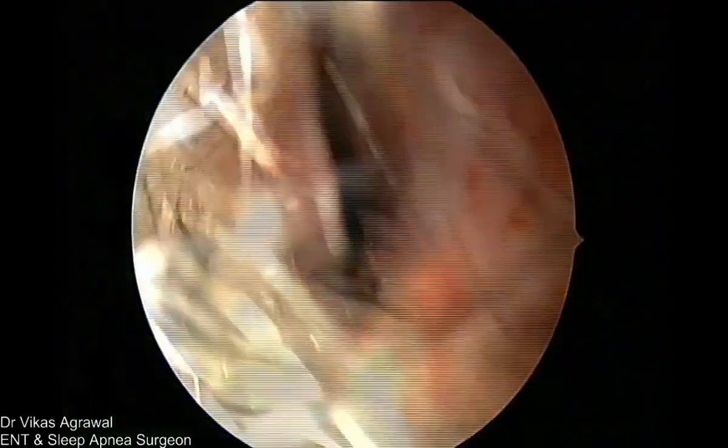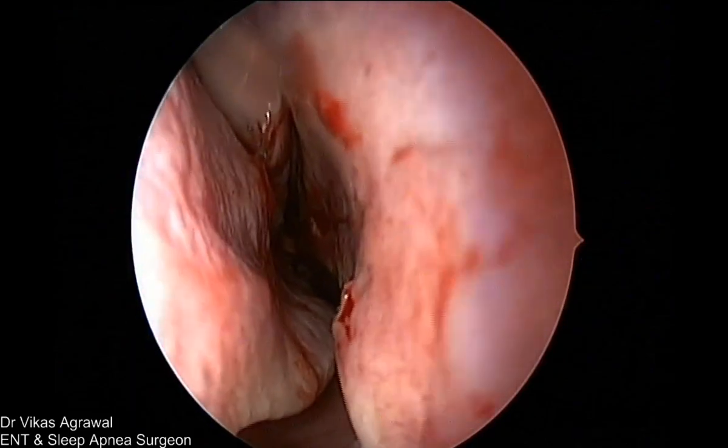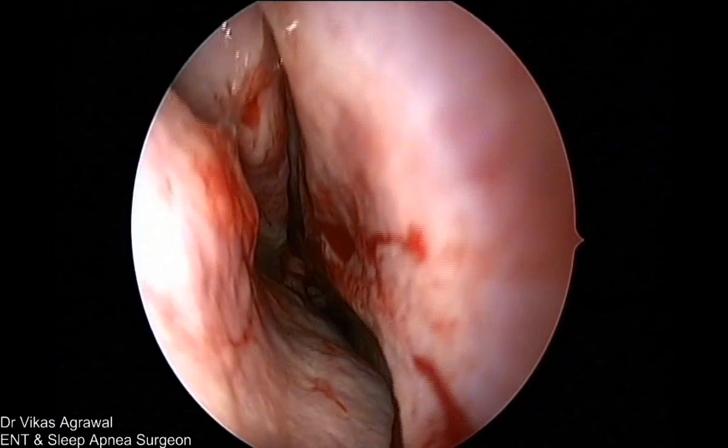So you can do either channeling of the turbinate or you can do a turbinoplasty. Possibly I'll demonstrate a turbinoplasty here. It's not going to look so impressive, but I'll explain to you the difference.